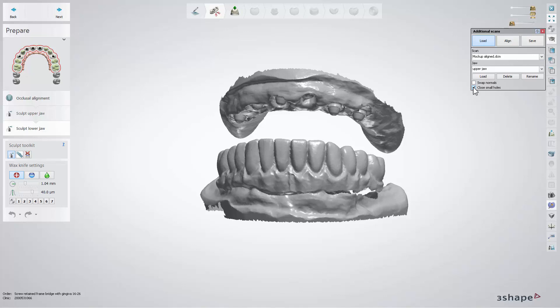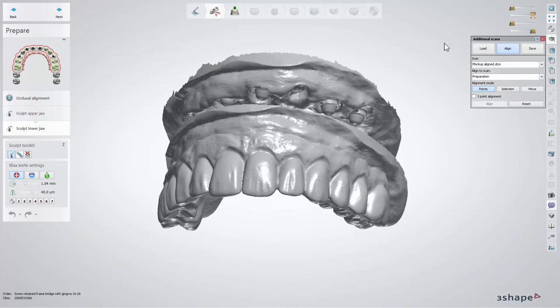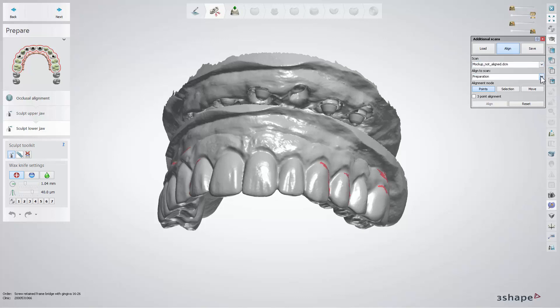Align is the second functionality that allows the alignment of scans. You need to select an additional scan and then the scan to which to align it. Alignment can be performed between any scan that belongs to one jaw. You can do it by adding corresponding points into the scans.